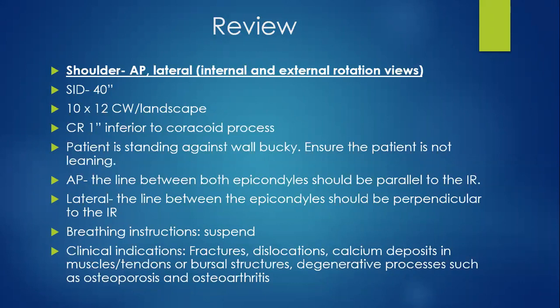Breathing instructions is suspended. That means you're going to stop breathing, in, out, doesn't matter, inspiration, expiration. Just tell your patient, hold your breath, don't breathe, don't move, and expose, take the picture. Clinical indications: fractures, dislocations, calcium deposits in the muscles or tendons, or bursal structures. Degenerative processes such as osteoporosis and osteoarthritis can also be seen.